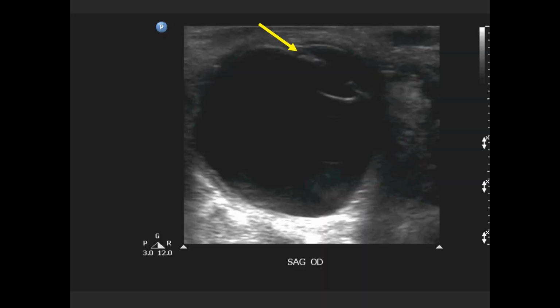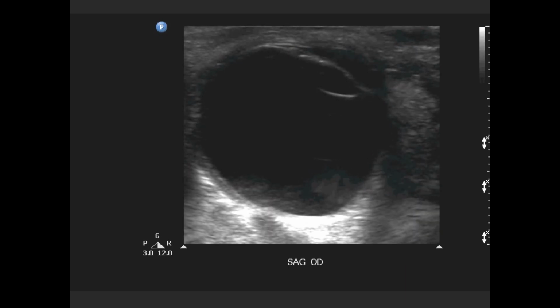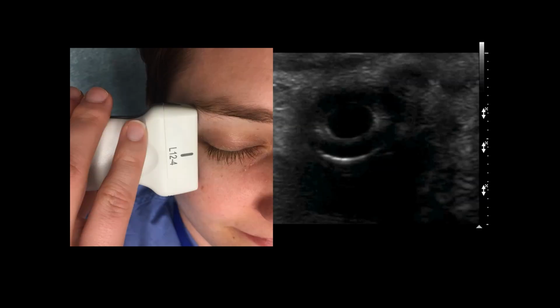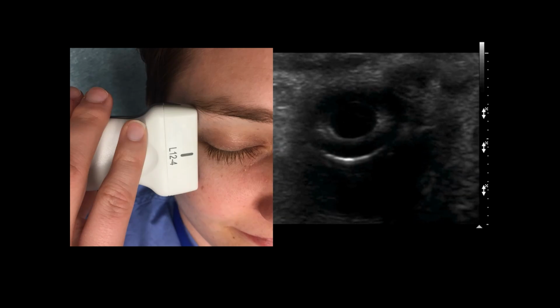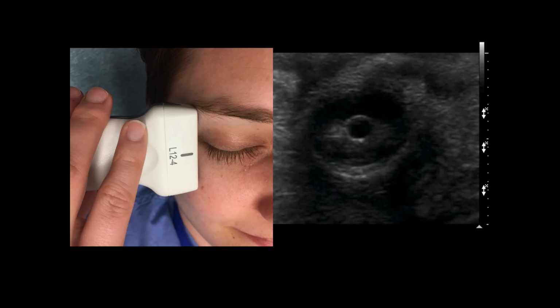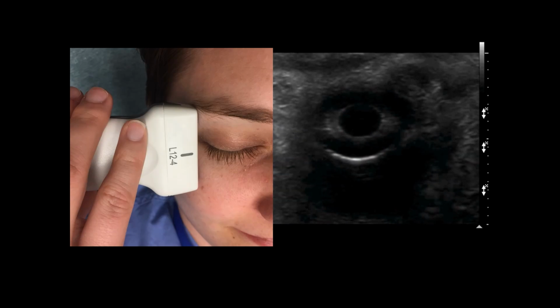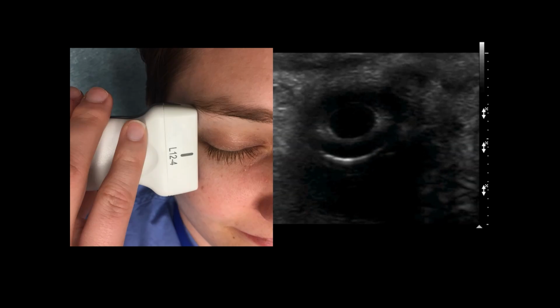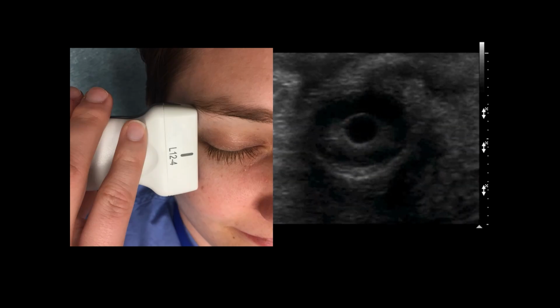So there's our nice eye with our iris, and unfortunately in my video the eye is a little off to the side, but you can see the iris, and you can see that with the application of light, it constricts, so the pupil becomes much smaller. However, this is much more easily seen if you come laterally or from the inferior position and scan the eye. So here we have our light being applied, and our pupil is nice and small. So if you ever need to assess pupillary constriction for a direct response or a consensual response, and you can't actually open the eye, you can do this with the lids closed.